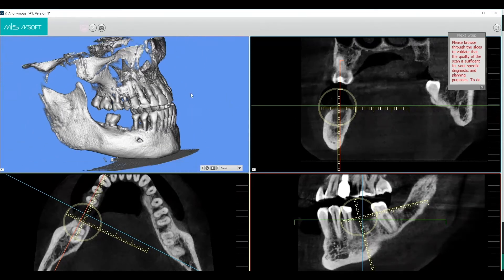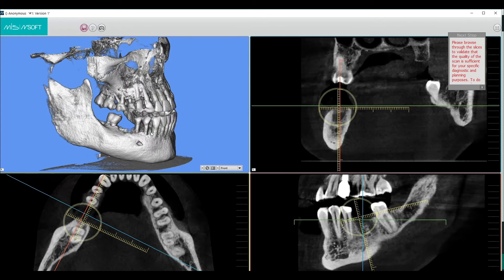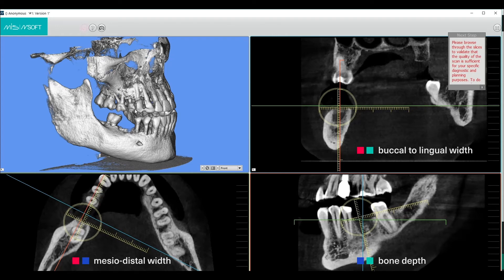Each line is 1 mm. Red and green is the buccal to lingual width. Blue and green is your bone depth. Red and blue is the mesiodistal width.